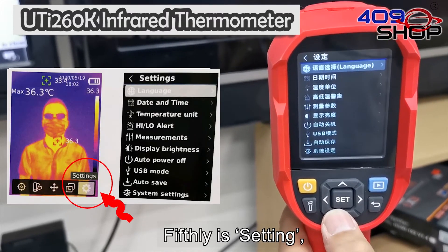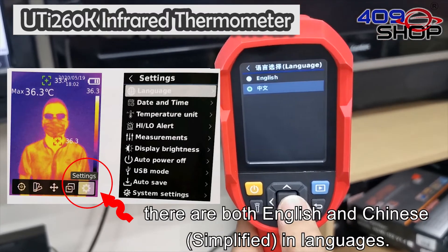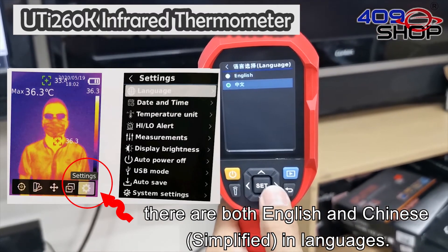Fifthly is the setting menu. There are both English and Chinese language options available.